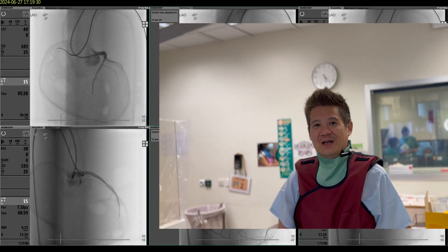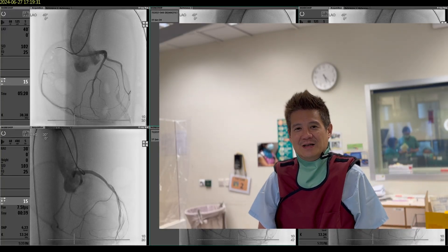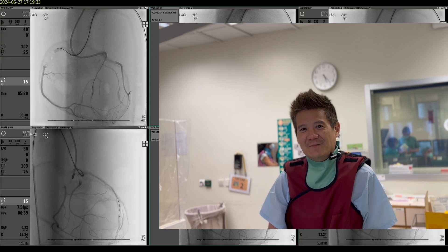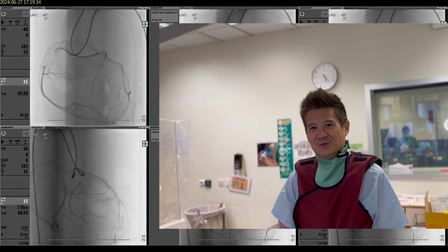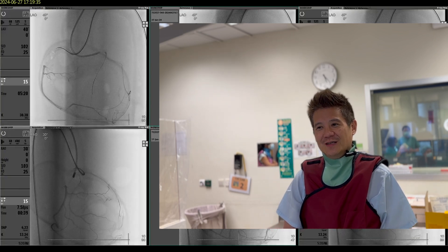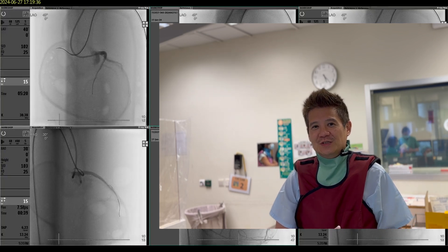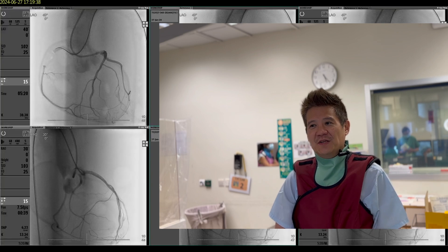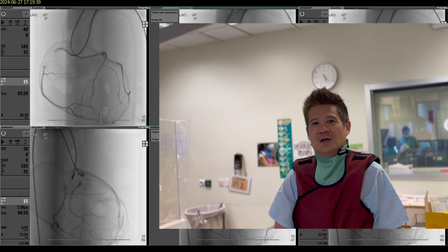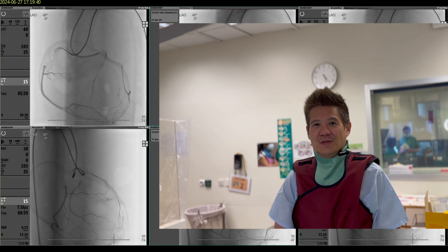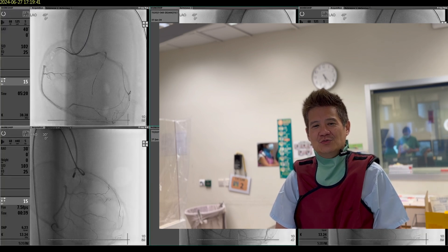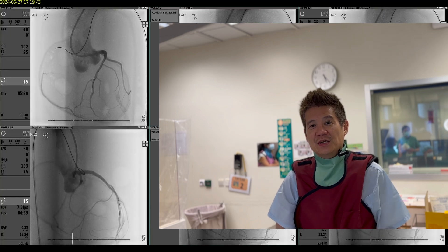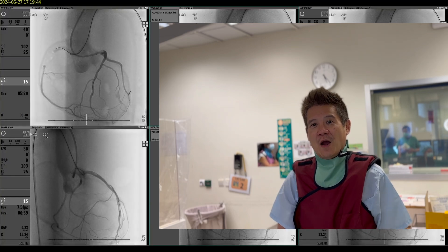Welcome CTO Daemon channel friends. You have come to CTO Daemon's cath lab in the Prince of Wales Hospital in Hong Kong. Today we are testing a model — a beating heart model of a CTO in the RCA — to really learn about 3D fluoroscopic wiring.